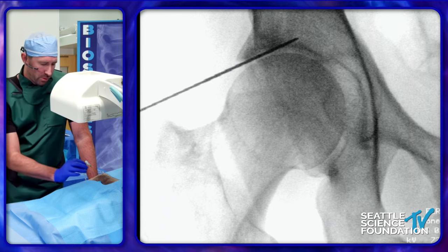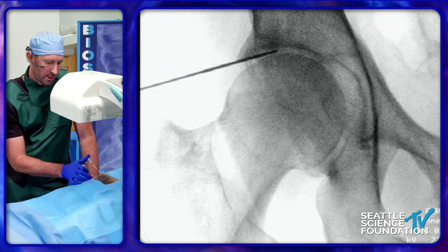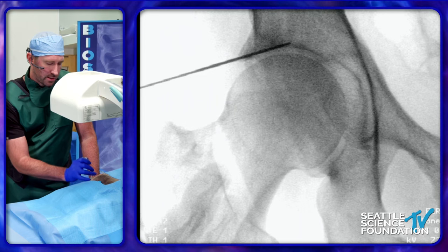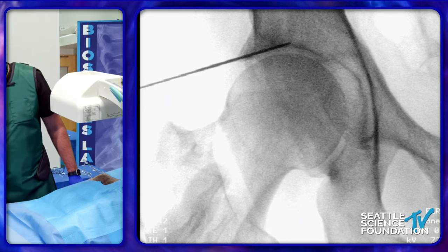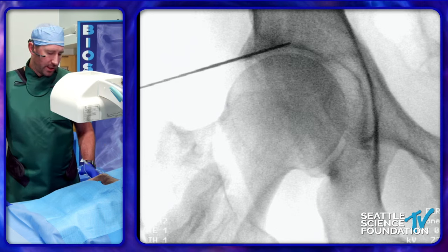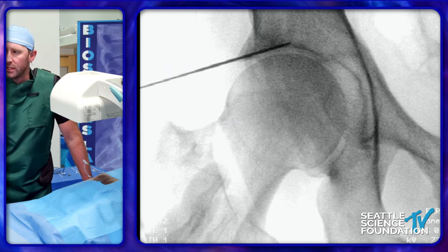We pull back a little bit — we want to get away from the articular surface, just on that superior acetabulum. We're going to stimulate for motor because we are doing the articular branch of the femoral nerve, but we don't want any motor involvement with the femoral nerve, since it innervates the quadriceps — we're in a world of hurt if we ablate that. The benefit of this Avanose needle is that it uses a cooled system to keep the needle tip temperature at 60 degrees Celsius while the ablation zone around the lesion gets up to 80 to 85 degrees Celsius.